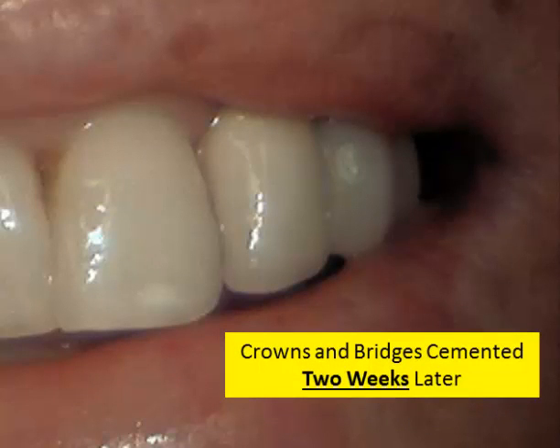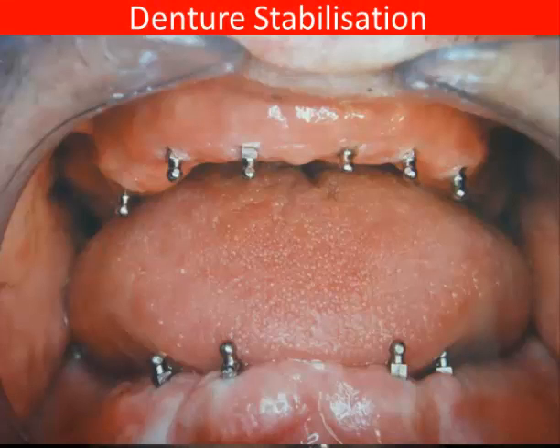The porcelain tooth is usually fabricated within about two weeks from the time of insertion of the implant, and we can use this not just for replacement of single missing teeth but multiple missing teeth. In the last video, we had a look at how dentures can be stabilized using these implants.